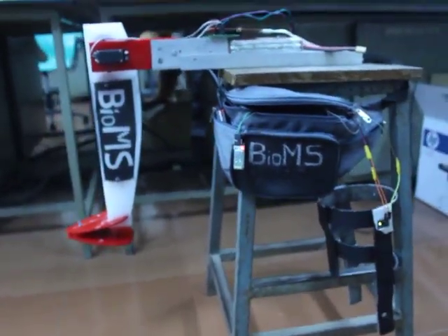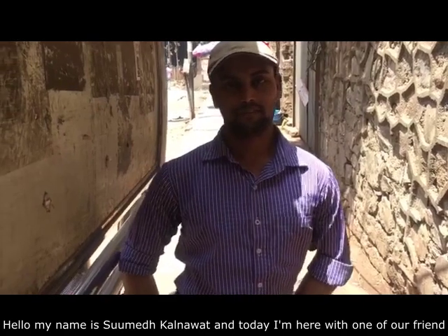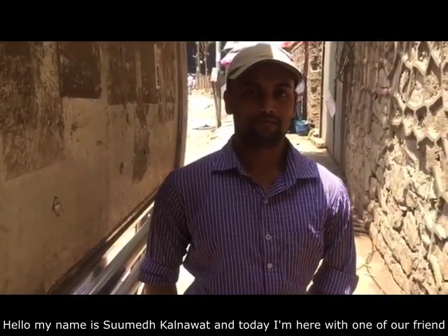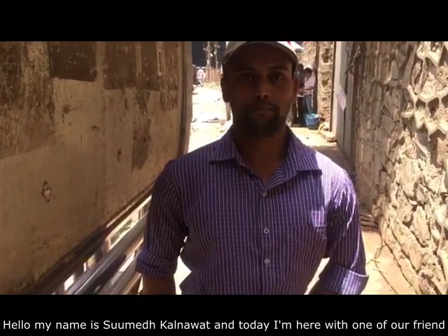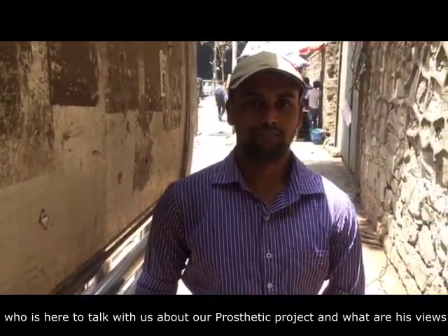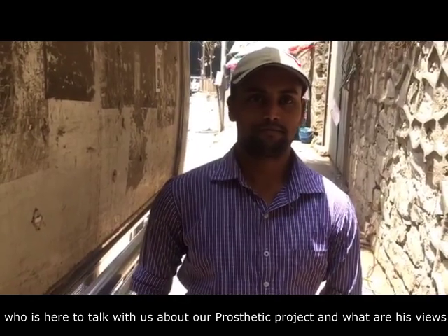And now our customer review. My name is Sumit Kalnavat, and today I am here with one of our friends who is here to talk with us about our prosthetic project and share his views.